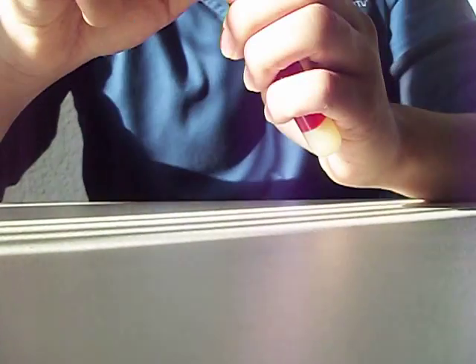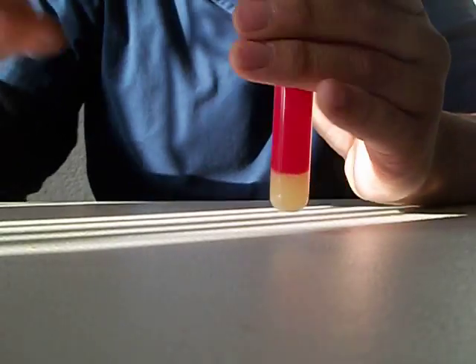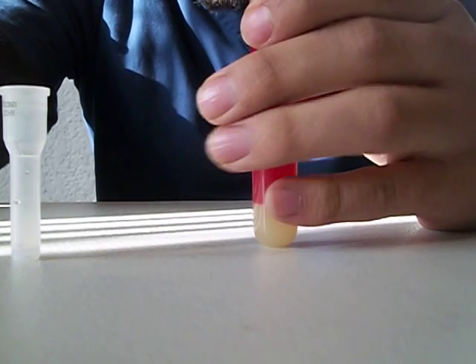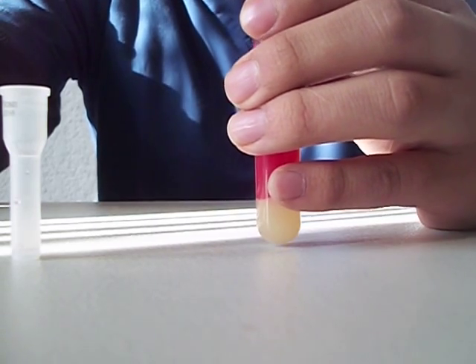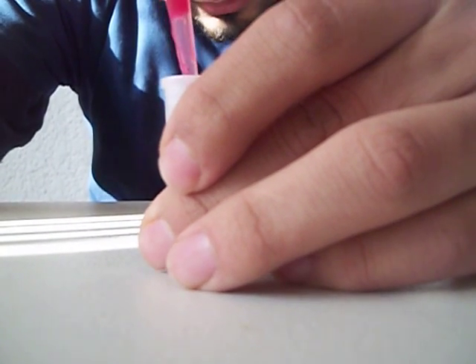First of all I'm going to start by opening the blood sample right here, and then I'm going to get this small tube right here. With the pipette what I'm going to do is get blood from right here — perfect. Okay, I'm going to put this aside and then I'm going to fill this ESR tube with the blood.